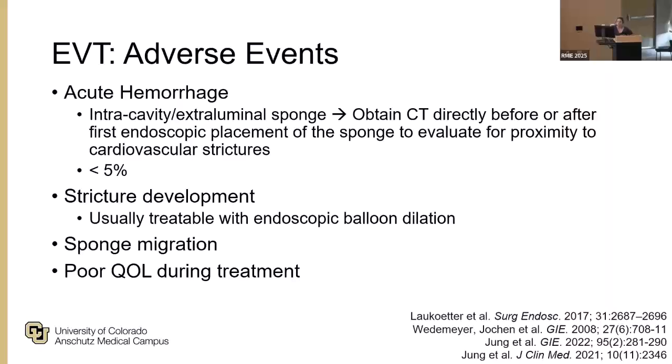aortoesophageal fistula. Another case that's been described is development of a right atrial pseudoaneurysm with a sponge that was placed in close proximity to the right atrium, which led to rupture and death. But overall, this complication is rare.